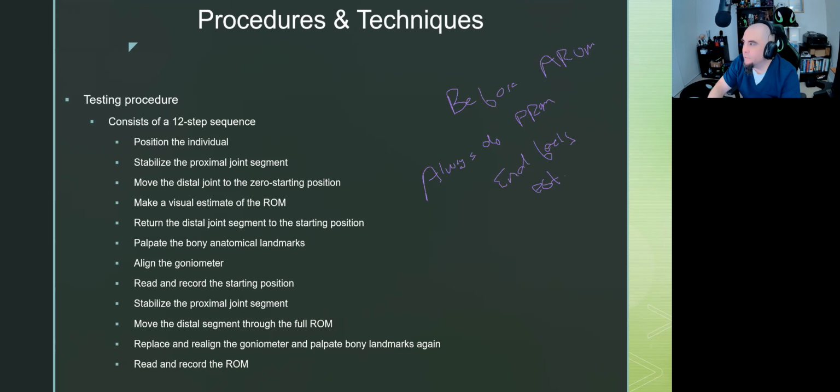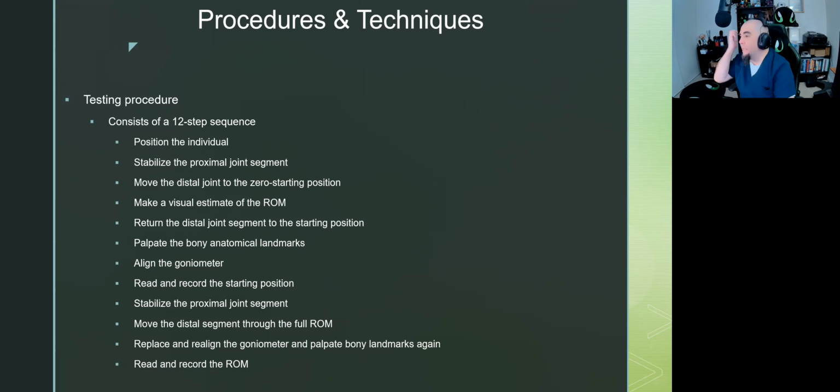The whole time you're going to move, some of your bony landmarks are going to move on you. End feel either closer to 0 or close to the other. So there's going to be an end feel out here on the elbow, and there's going to be an end feel right here. So you got to kind of measure both, estimate both of them, kind of go, oh, well, that's bony. Oh, well, that's soft, right? Because I've got my tissue kind of squishing up here.